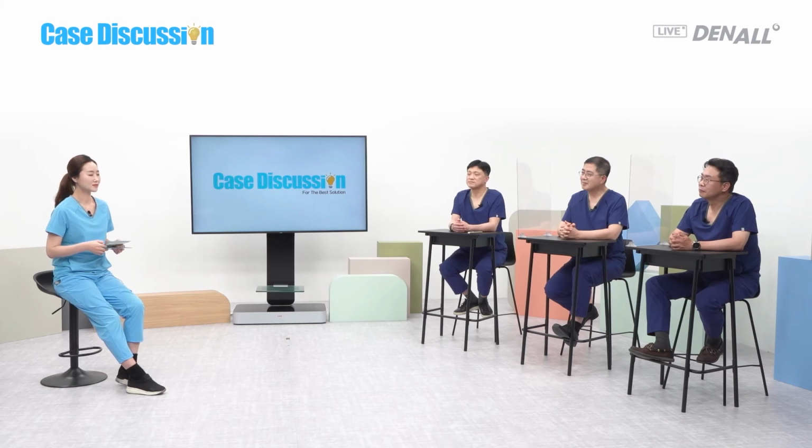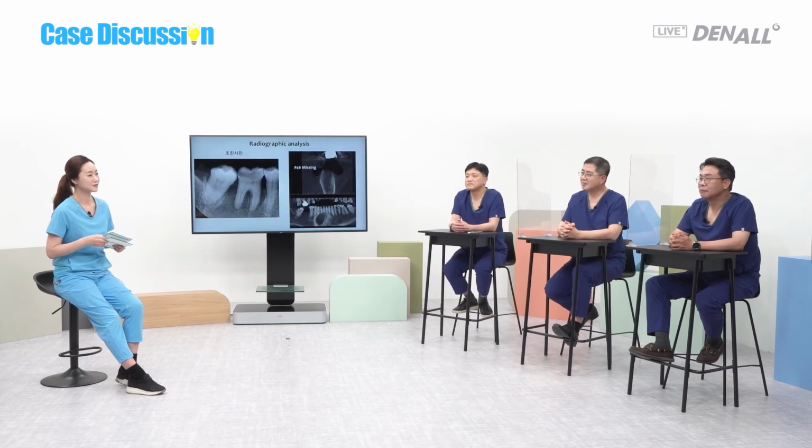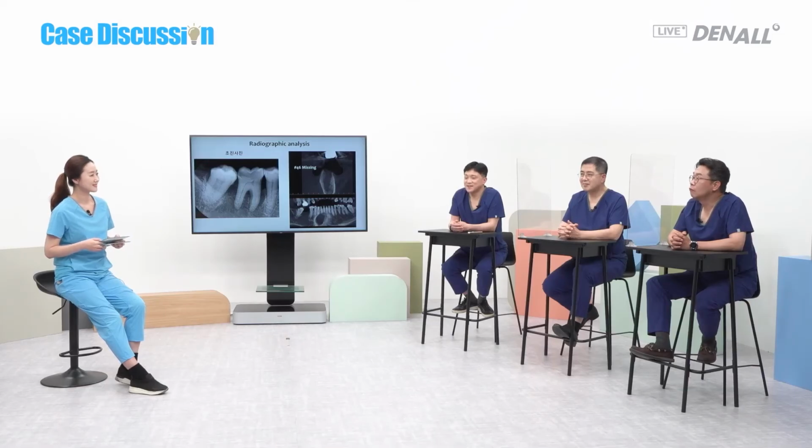Let's go back to the case under discussion. Based on what we have discussed, how would you conclude? As I said before, using a guide, under drilling, and using a good implant surface. Under drilling, wide fixture, submerge, and wait. That's what I recommend. I agree to all of those.